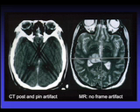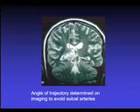In this image on the left, we see a CT scan in a patient with a thalamic lesion where artifact from the post and pins has completely obscured the target. Thus, CT was not amenable to targeting. We then took the patient for an MRI scan, which does not have post and pin artifact, and the lesion can be seen and targeted as noted in the right-sided image.